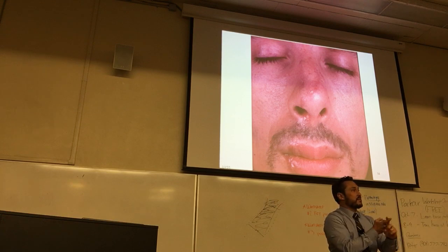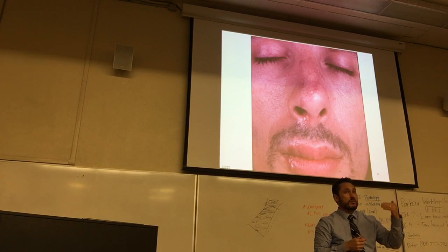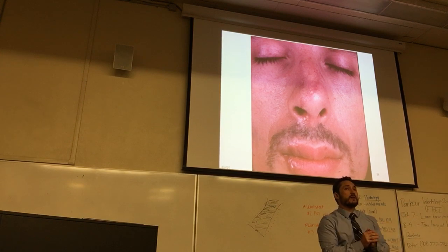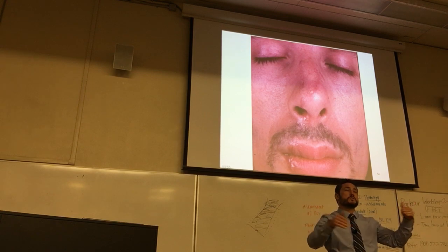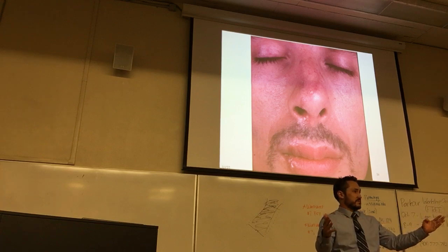I definitely see evidence of regeneration, because you see all the things that was described with respect to hair follicle restoration. Looks like sebaceous glands are working. And then we also see some areas maybe where there was more aggressive wounding. Maybe the first intention approximation wasn't perfect, and we see more evidence of some fibrotic scarring. Okay, so it's a spectrum. I just want you to walk out of here understanding that it's not necessarily they're mutually exclusive.